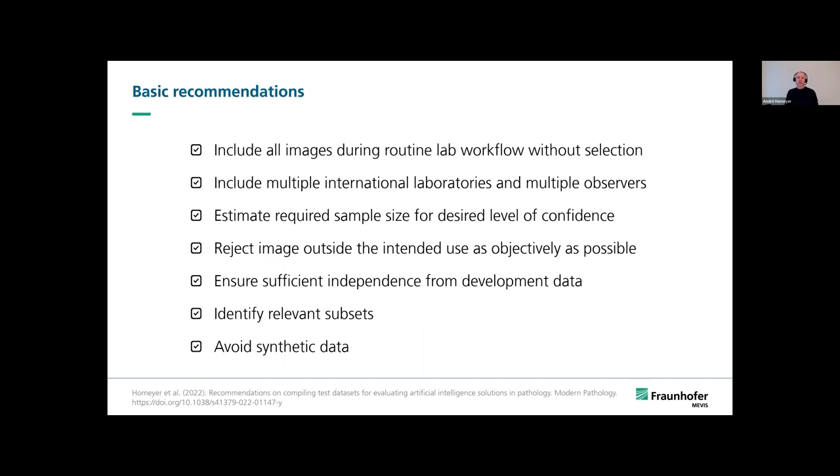Laboratories differ in their spectra of patients, diseases, of technical equipment and operating procedures, and also humans have different subjective biases. Then one should estimate the required sample size based on confidence intervals. Test data sets are always samples from the real-world population of images, and that is the total amount of images that an AI solution is supposed to work on. And any performance metric computed on these test data sets is therefore subject to sampling error.